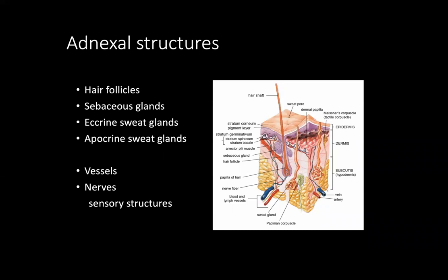But just understand sebaceous glands are a huge cause of sebaceous neoplasms. And you can have a lot of them even on the face. So if you have a lot of sebaceous glands on the biopsy, you can predict you're probably on the face. Now together, the hair follicle and the sebaceous gland make up something called the pilosebaceous unit.